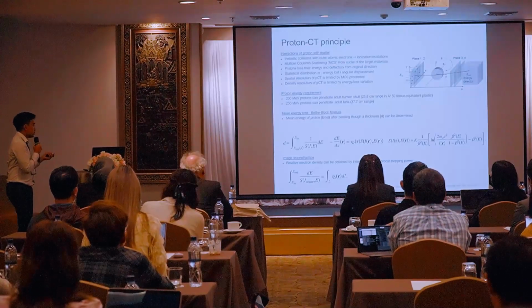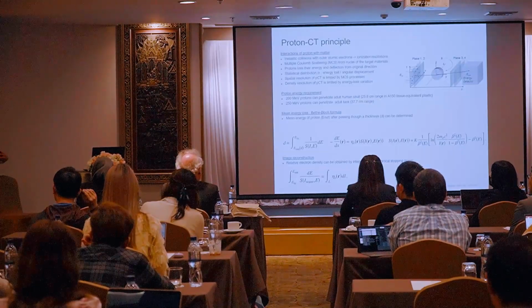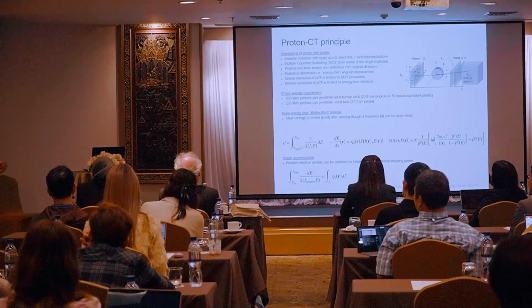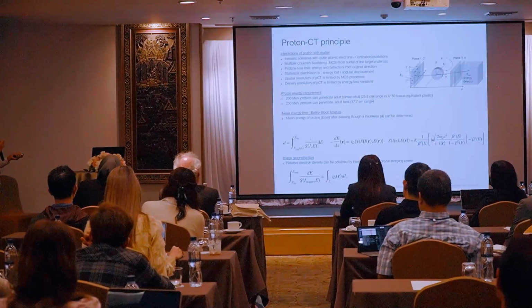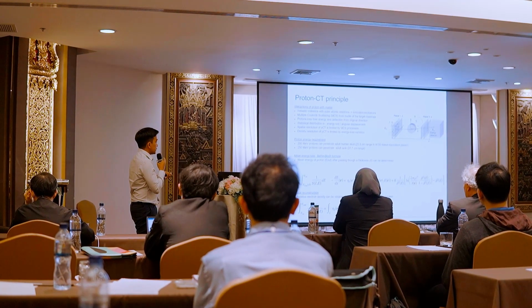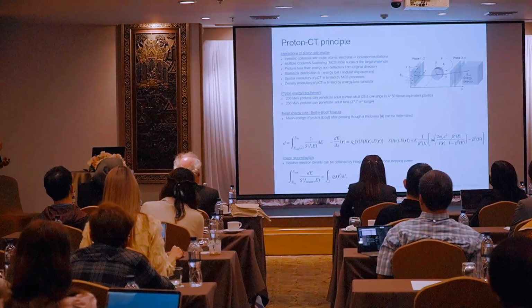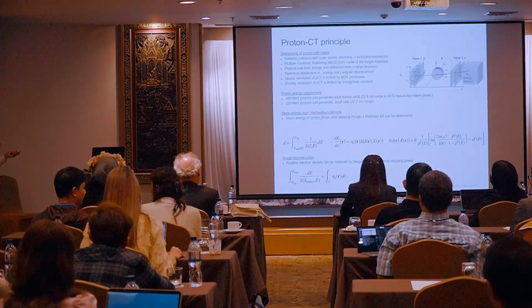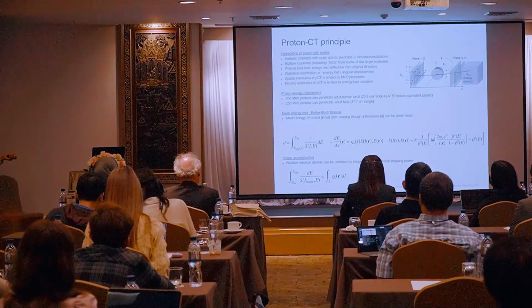Well, because of the multiple Coulomb scattering, the principle of image reconstruction is not like X-ray, right? With X-ray, you just send the X-ray and see how much X-ray is left. You have a black-and-white picture because some organs absorb the X-ray. But here you have to get information from the energy that is really deposited, which should be related to the electron density of the phantom or the organs. And also for the spatial information, you probably need to know the angle that the proton really deflects. But of course, due to the multiple Coulomb scattering, you probably need a clever algorithm to track the proton, or you probably need higher statistics to really track the proton.